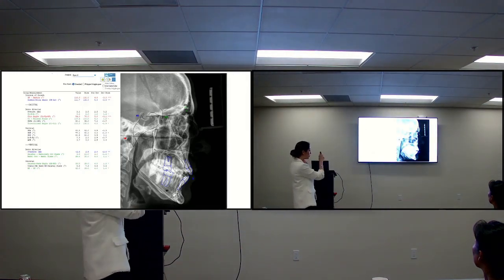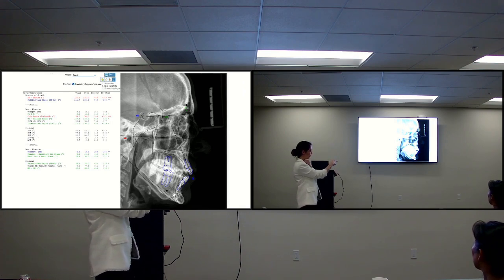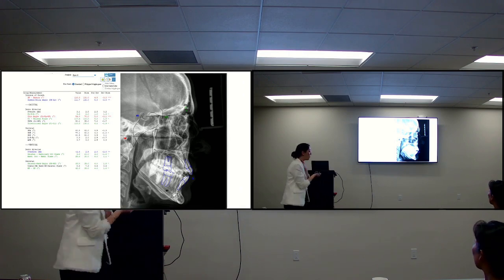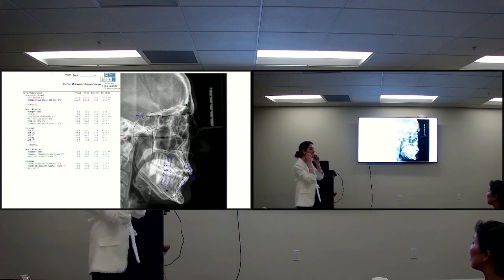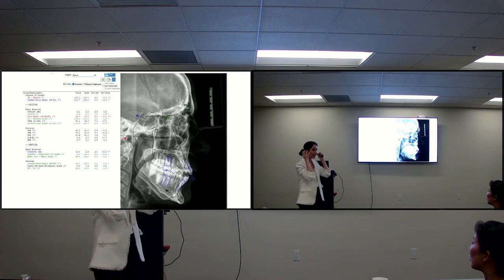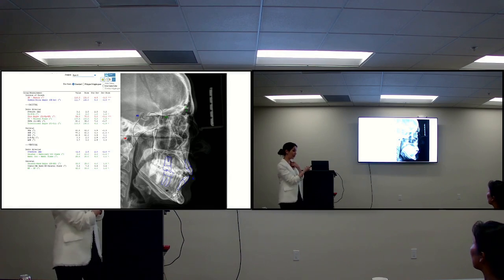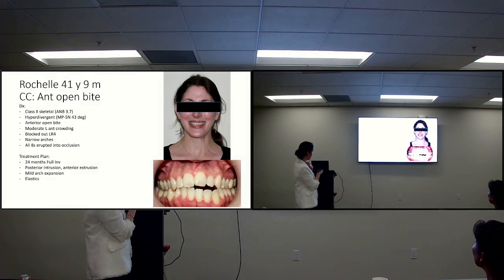Anyway, really nice lady, super hyperdivergent. If you have this level of mandibular angle with an anterior open bite and wisdom teeth are present, this is your biggest nightmare. You don't want to treat this case. But I'm showing you this because Invisalign is so good at anterior open bite cases, because Invisalign is good at posterior intrusion. That biting force where they clench all day and all night intrudes the molars a little bit, so it's good for that kind of movement, better than braces actually. This case, I couldn't have done it with braces as well as I did it with Invisalign. So anyway, this is her treatment.